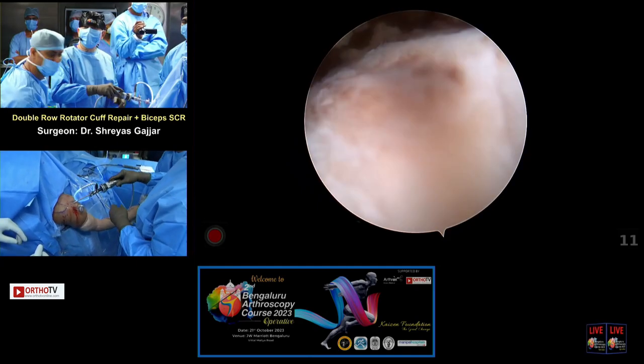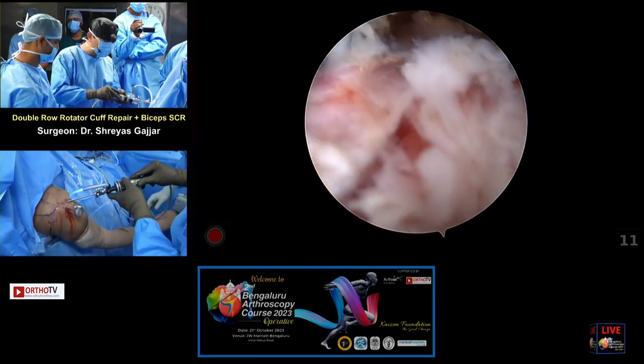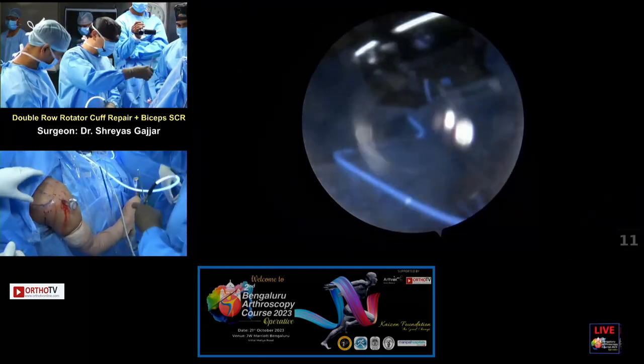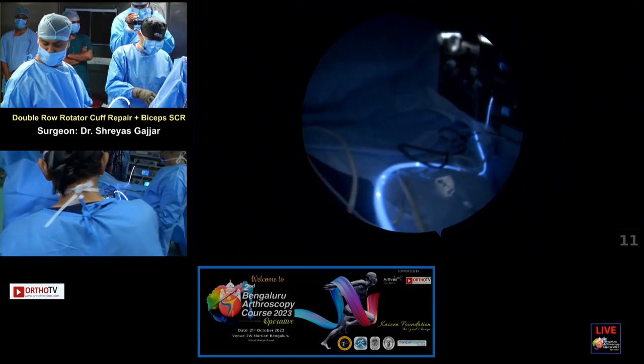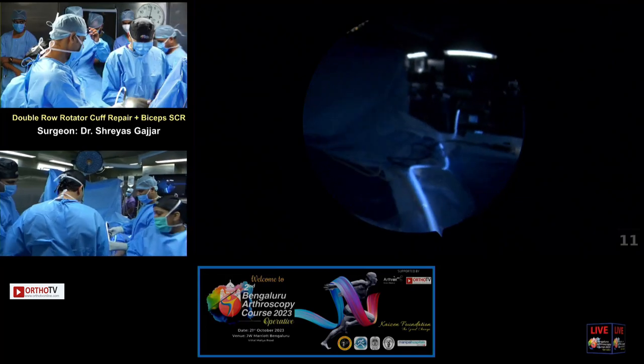I'll just take you through the arthroscopic image. I'll answer your question in a second, yeah? So we'll go into the glenohumeral joint now. Straight, do. Can I have a trocar, please? I'll come there, Akshay. Shaver has to go in, Rohit. Okay, in a second. Hold this, please, Akshay. Any questions from the audience?